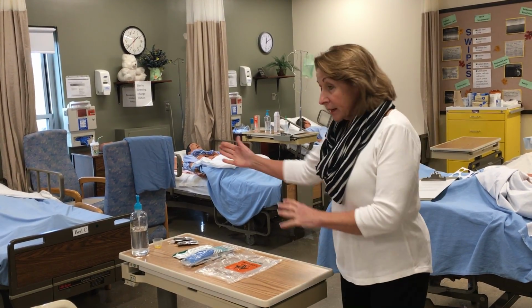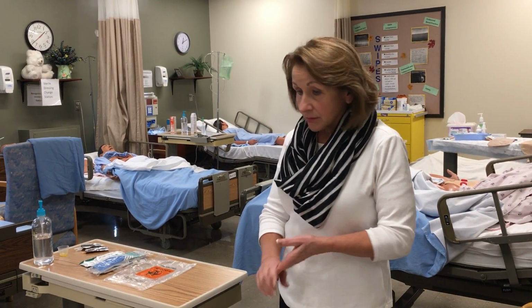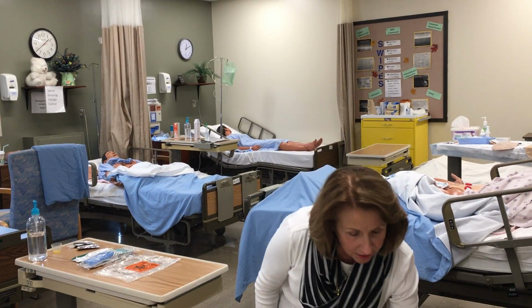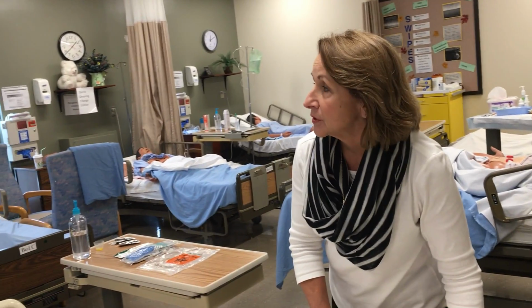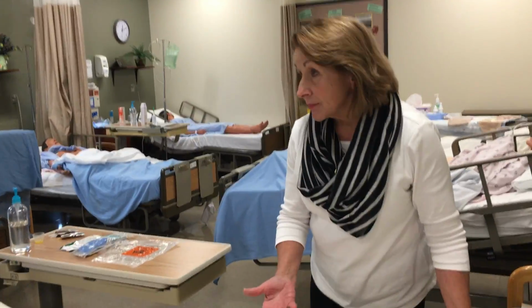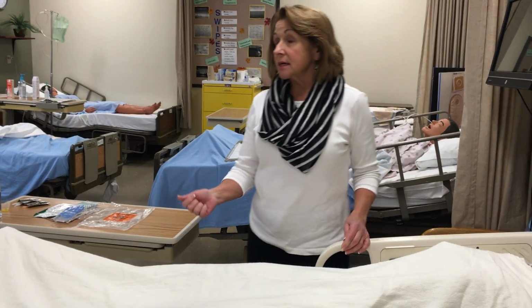So, we're going to come into our patient's room. What's the first thing we're going to do? Swipe, introduce yourself, and explain everything. Yep, you guys know the routine. And then what are we going to do? Raise the bed. Let's get our patient in position. What position are we going to place our patient in? Is it a male or female? It depends if it's male or female. Okay, we're doing a female. Dorsal recumbent, good.